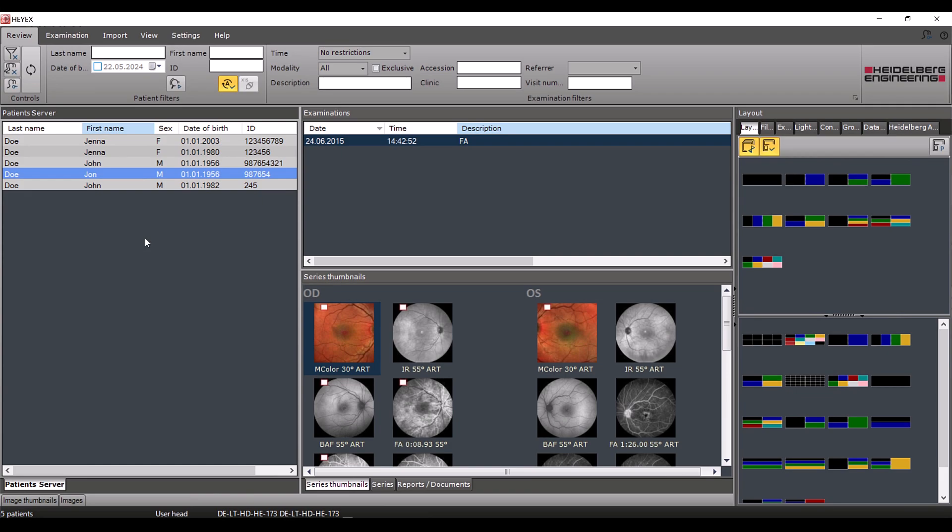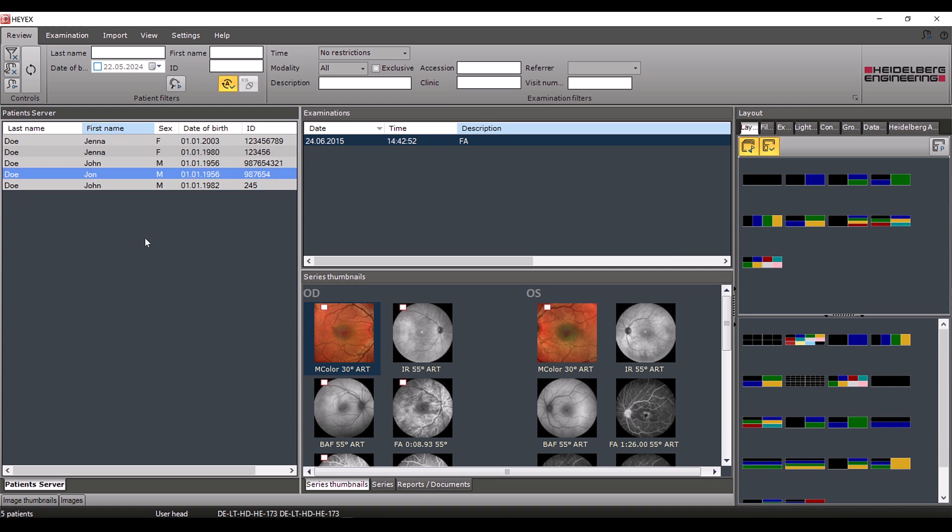If you enter patient data manually and it is not carried over from a leading system, a typing error can easily occur, as in our example with Mr. Doe, whose first name is actually spelled with an H. To change patient data, right click on the respective name and select rename patient.